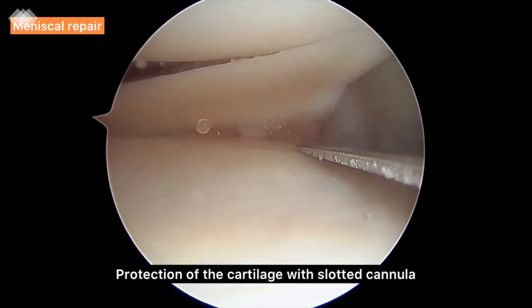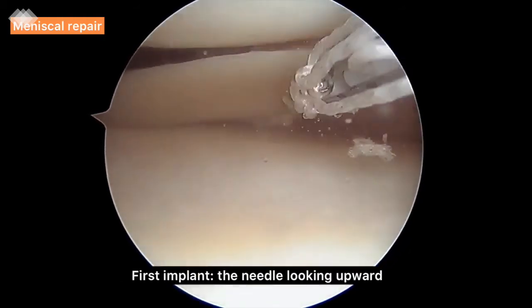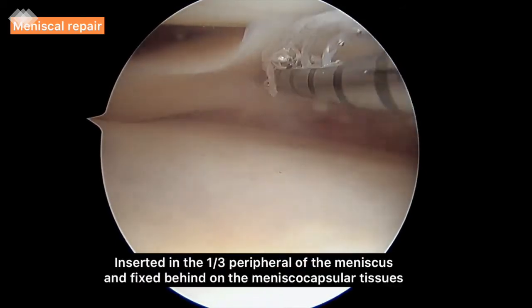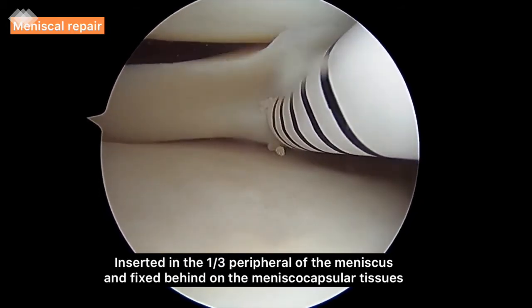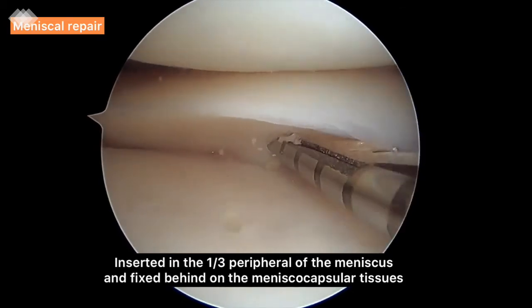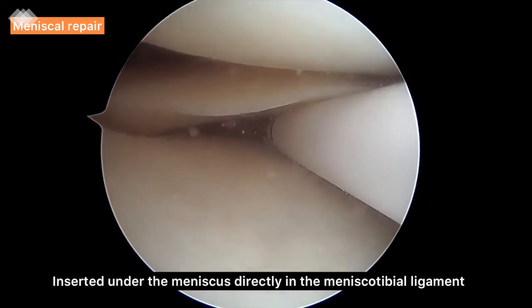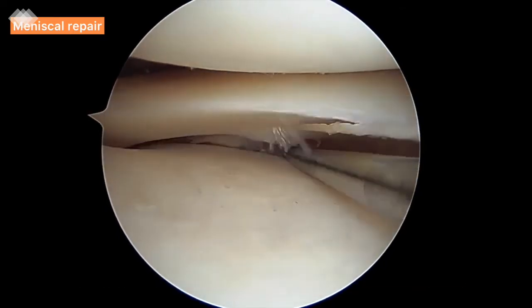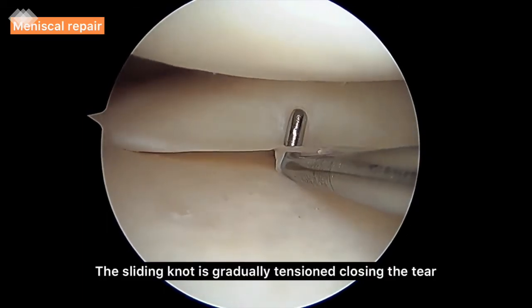With a slotted cannula to protect the cartilage, the device is advanced under the meniscus close to the meniscal tibial ligament tear. We insert the first implant obliquely with the needle looking upwards in the peripheral third of the meniscus and fix it behind on the meniscal capsular tissue. The second implant is introduced under the meniscus with the needle curved downwards and directly inserted into the meniscal tibial ligament. The sliding knot is gradually tightened, closing the tear with the knot pusher or hook probe.